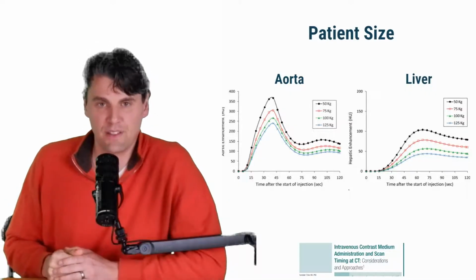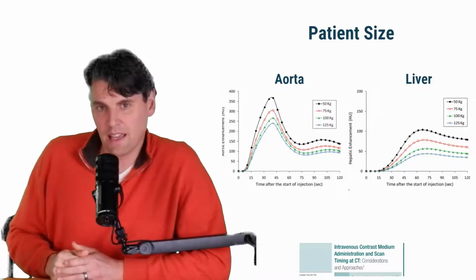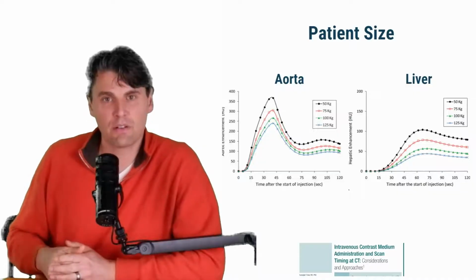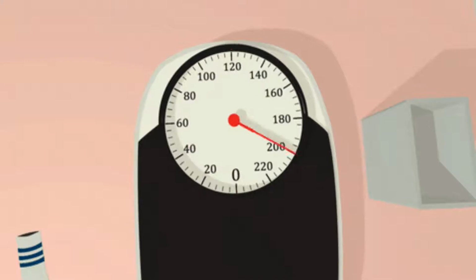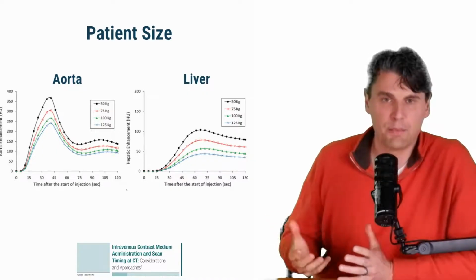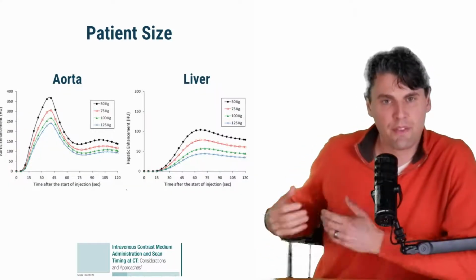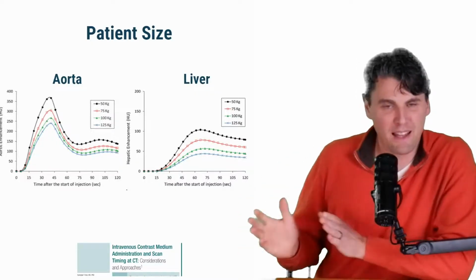First thing is the patient size. So how does the patient size actually matter here? What matters is the fact that the blood has to get pumped throughout the cardiovascular system, and the volume of blood that's there is related to how large the patient is. So the weight is a relatively good surrogate for how much blood is on board. Ideally, you would do something like the lean mass, because if you have a lot of extra fat around your body, it's not going to be changing how much blood you have that dramatically. But in general, don't let the perfect be the enemy of the good.